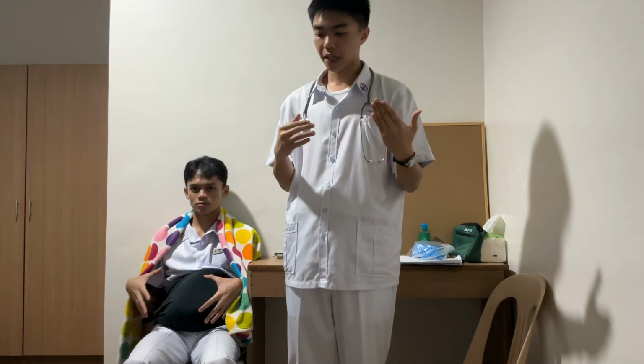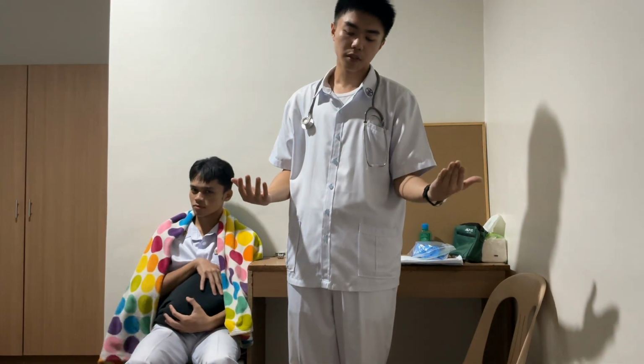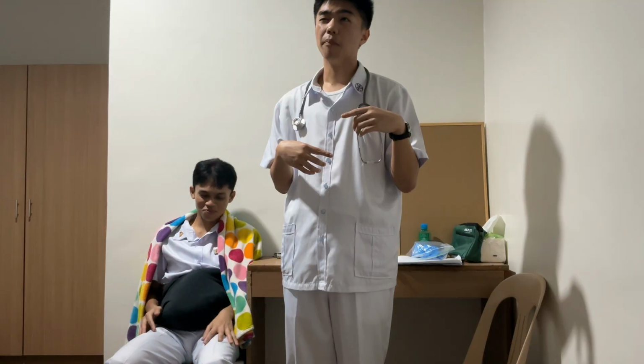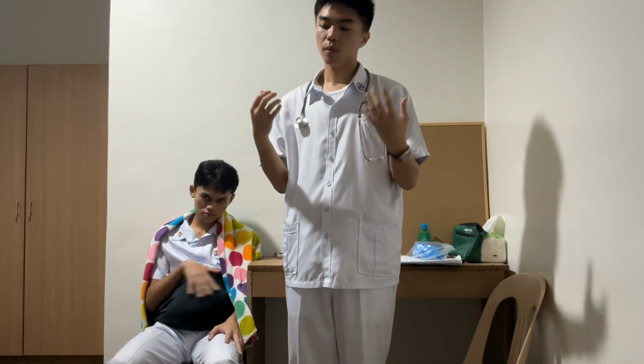You can also take the other side of the arm. If you already took the left, you can take the right, then compare the results. There should be no difference of at least 10 millimeters of mercury between the 2 arms. If there is, then wait again 1 to 2 minutes, and then retake both arms, then compare. Then that is the actual blood pressure of your client.